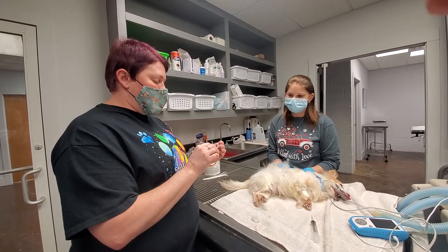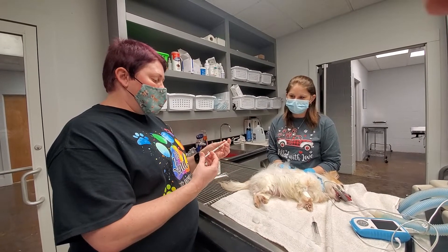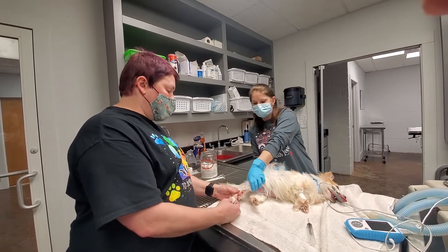Inspect my syringe — everything looks good. Pull back to break the seal. Bridget, if you would hold off, please.